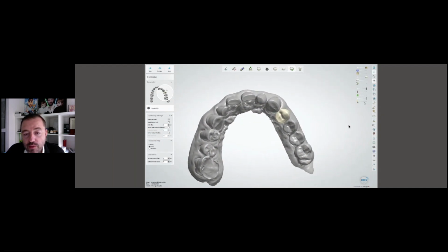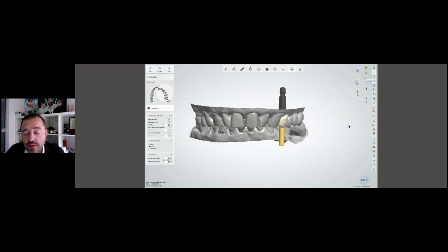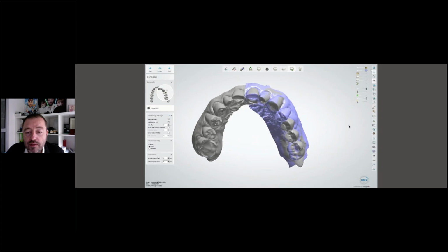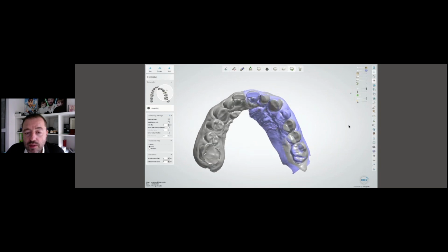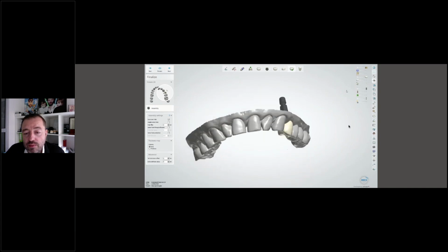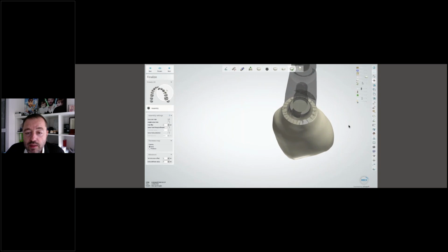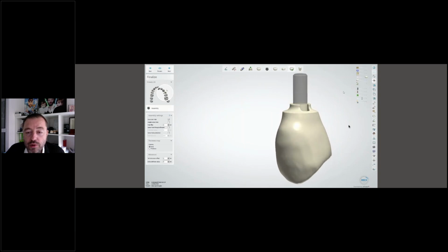Now, it was the same when we created the definitive crown. We were able to copy the initial natural dentition, as you can see. And of course, we improved a little bit the contact point, but we had the texture and the emergence profile of the natural dentition. And it was very nice that we created the design in Bucharest, and we sent the design to a TRI partner in Portugal.